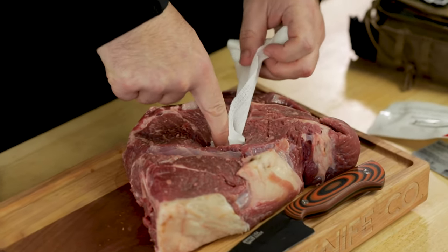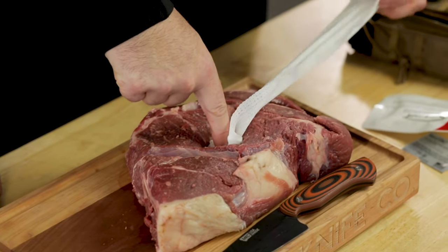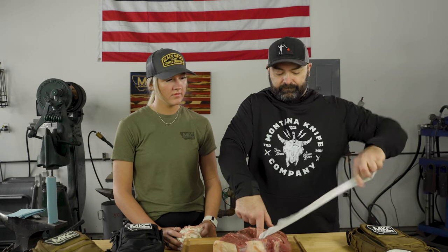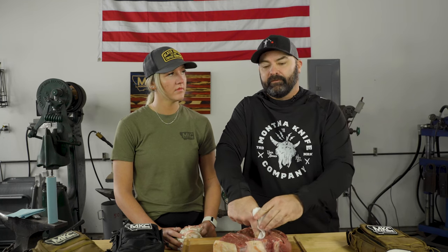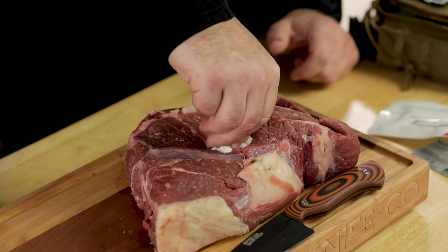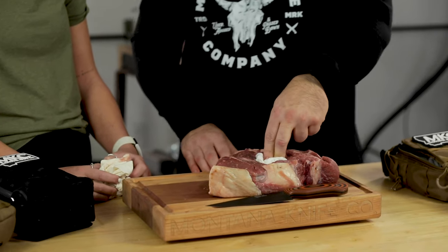I've completely filled the wound cavity with my QuickClot. Now I'm going to take the compressed gauze, unroll it, and wad it up — I want this to be a big wad to be able to put pressure directly on that wound. We have our impregnated gauze packed into the wound. Now we need to secure it so our patient can either walk or we can transport the patient out to higher medical care. We're going to secure this with a ball of compressed gauze and an elastic bandage, all of which are in your individual first aid kit.